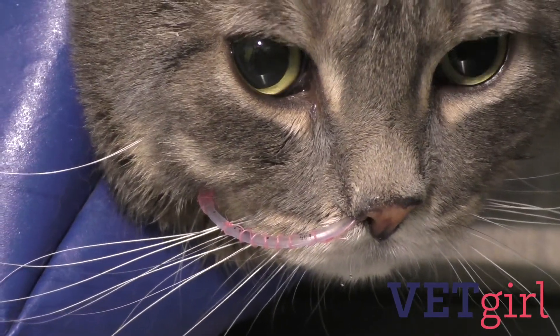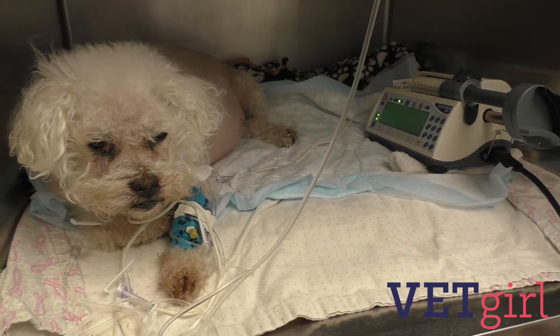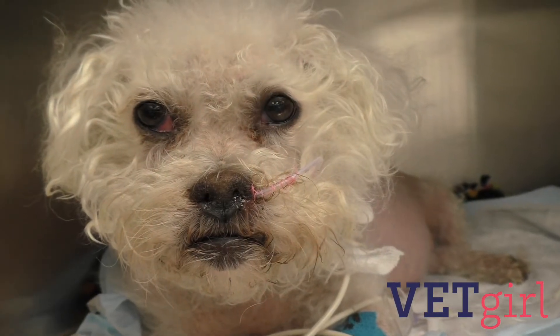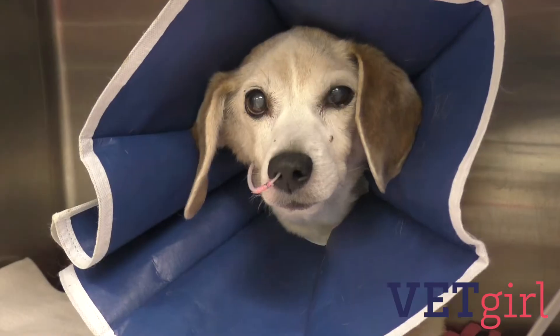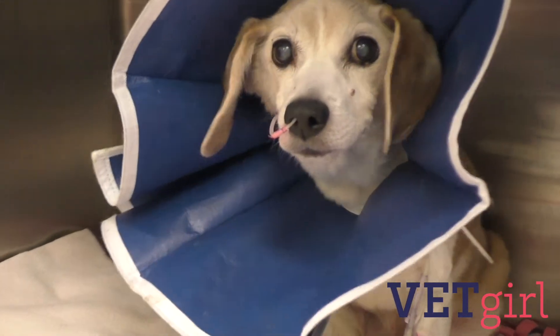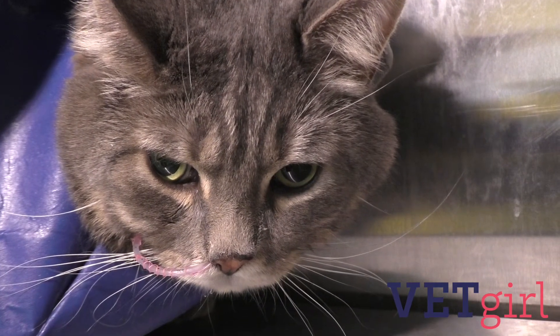NG or NE tubes are commonly used in critically ill patients to provide short-term nutritional support, measure gastric residual volumes, help with patient comfort and nausea levels by keeping the stomach empty, and potentially help minimize the risk of regurgitation and secondary aspiration pneumonia. They are often well tolerated and can be simply removed once they are not needed.